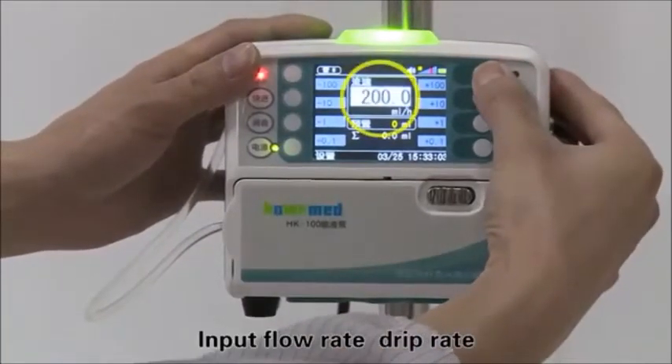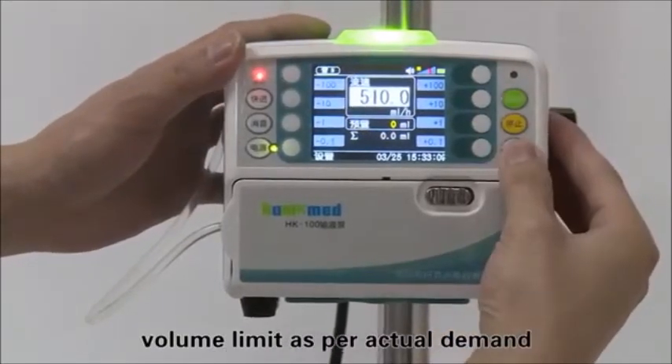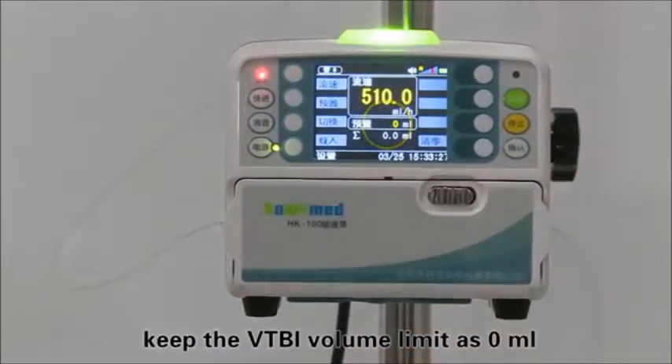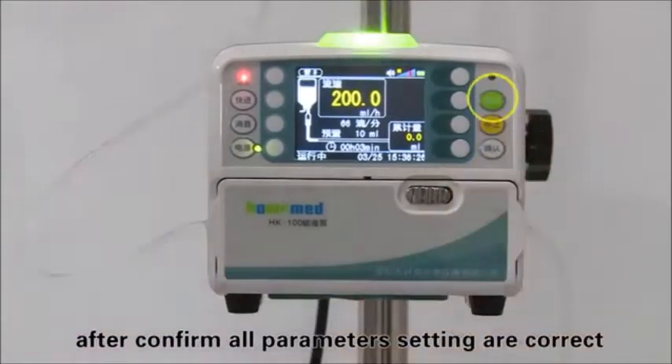Input the flow rate, drip rate, and volume limit as per actual demand. If you want to infuse the whole bottle of fluid, keep the VTBI volume limit at 0 milliliters. Press the start key to begin infusion after confirming all parameter settings are correct.